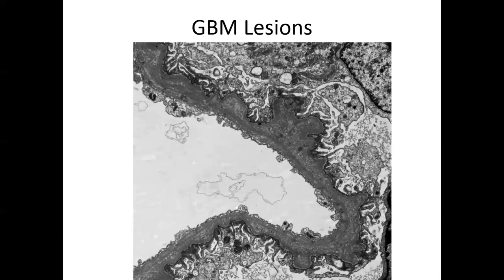Just more glomerular basement membrane lesions that have no evidence of electron-dense deposits, and the IFs were completely negative. So again, you can have abnormal GBMs, and that might be associated with podocyte damage. It might be due to podocyte damage, because as we said, the podocyte makes the GBM. And it could be a vicious cycle as well.